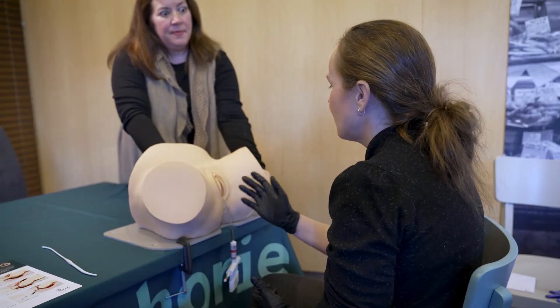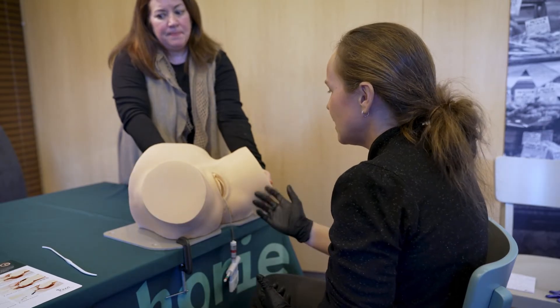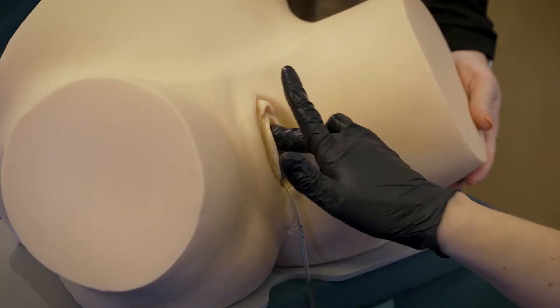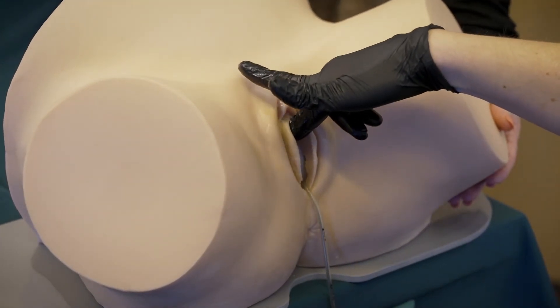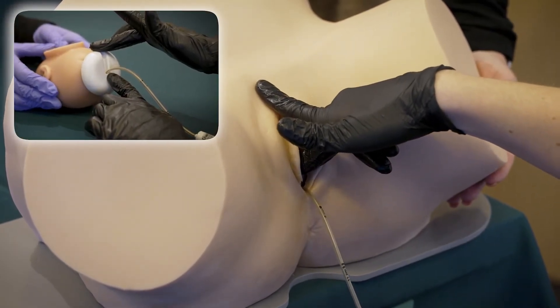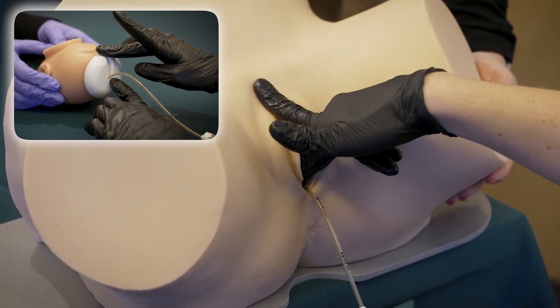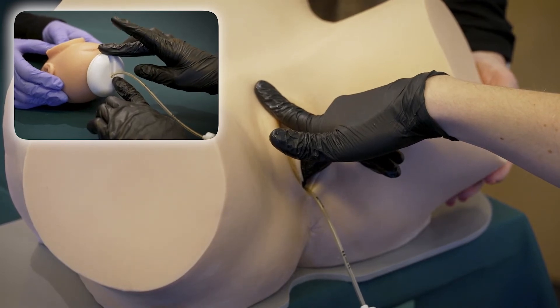Step three: move the cup from its initial position onto the flexion point. Place the middle finger of your examining hand above the cup at 12 o'clock and slide the cup downwards until you reach the cup insertion distance measured previously — in this case five centimeters.